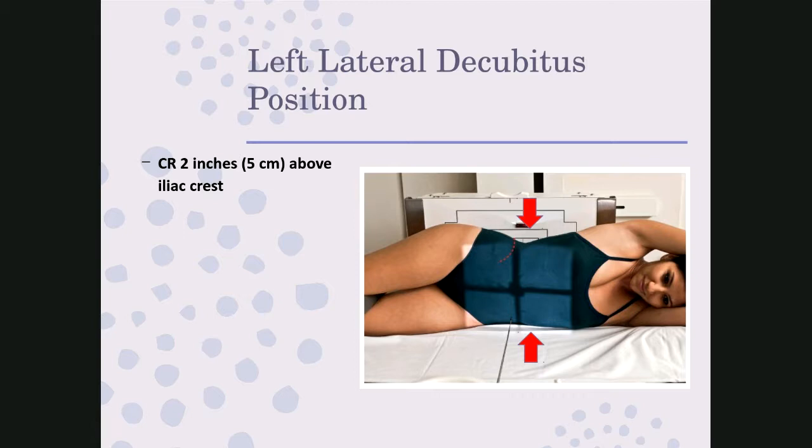As far as the position, she is in a left lateral decubitus, meaning she is lying on her left side, and she's on her lateral side, meaning the left side is down. And a left lateral decubitus, decubitus implies that it is a horizontal beam. Okay, so this particular picture, she's in a left lateral decubitus, and I will tell you that the left lateral decubitus is the most common position of the abdomen that we take as far as a decube.